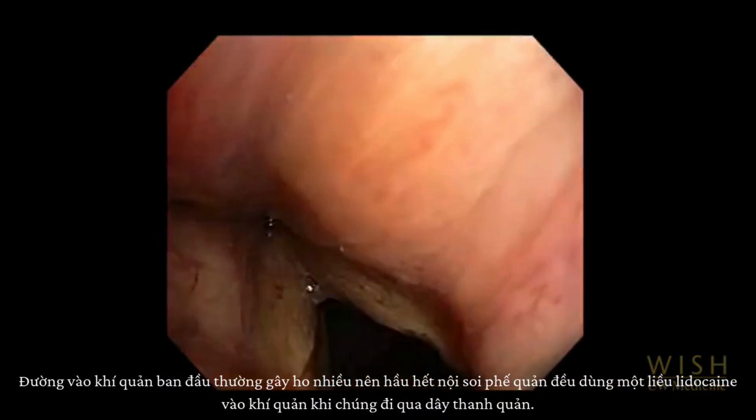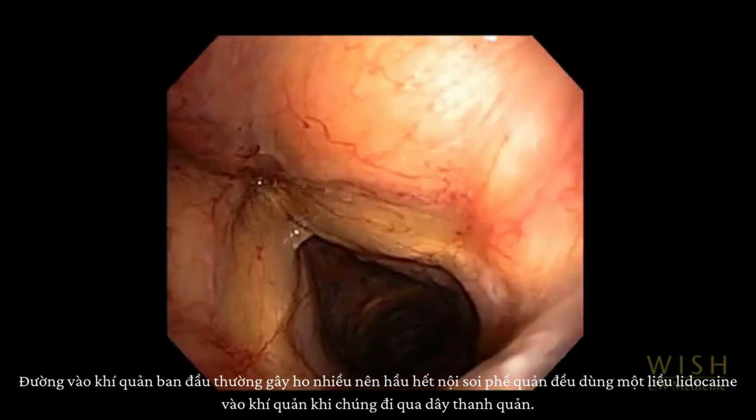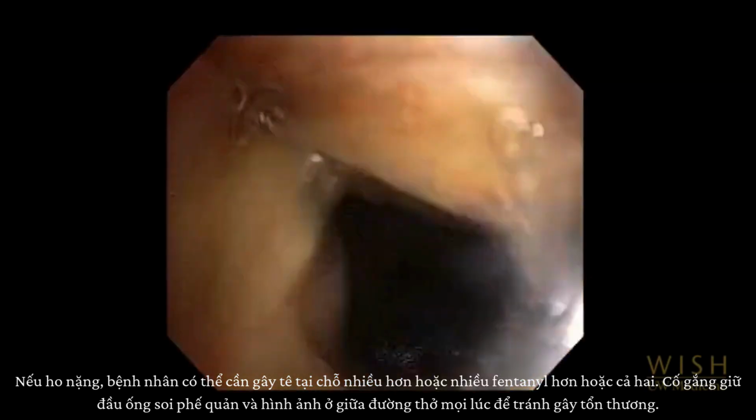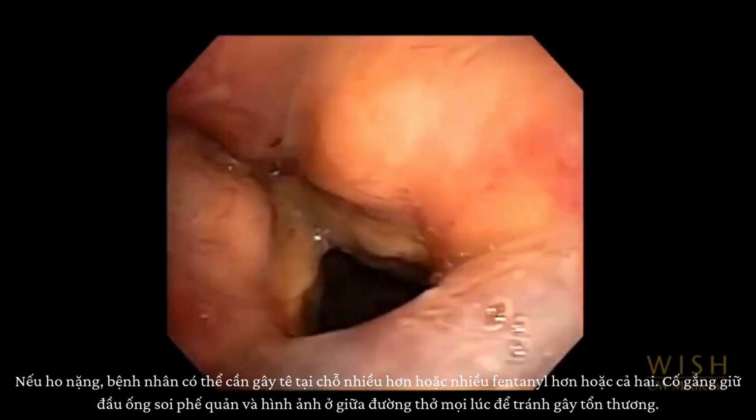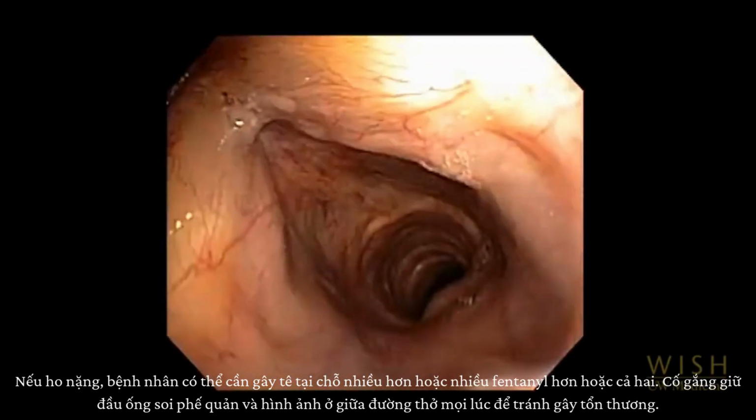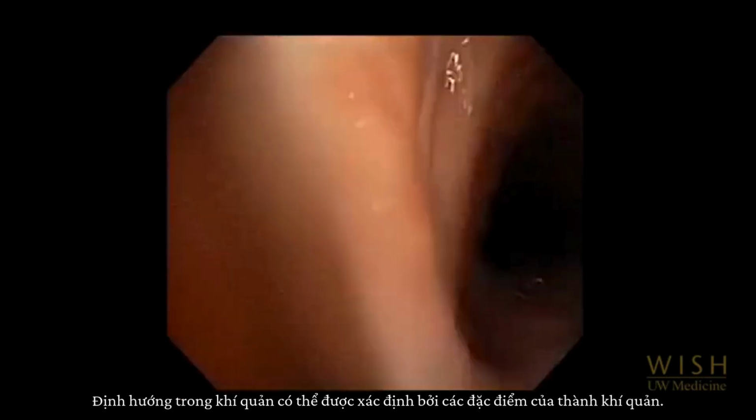Initial entry of the trachea often causes significant cough, so most bronchoscopists administer a dose of lidocaine into the trachea once they pass through the vocal cords. If cough is severe, the patient may need more topical anesthesia or more fentanyl or both. Try to keep the tip of the bronchoscope and therefore the image in the center of the airway at all times to avoid causing trauma.